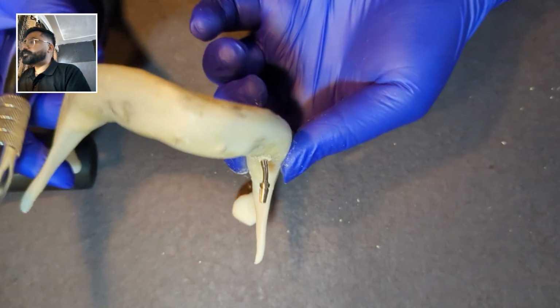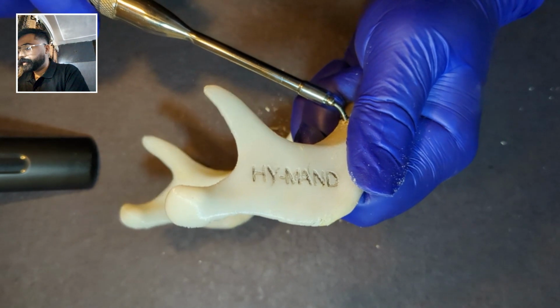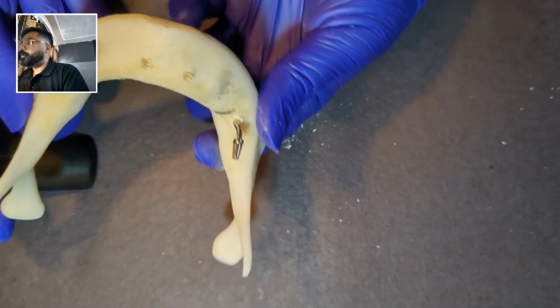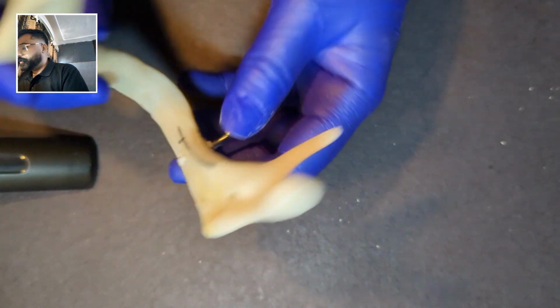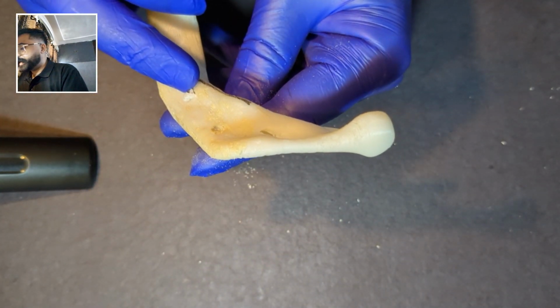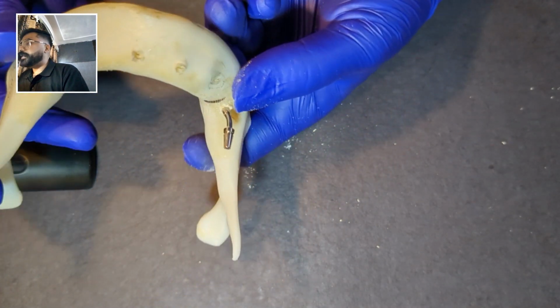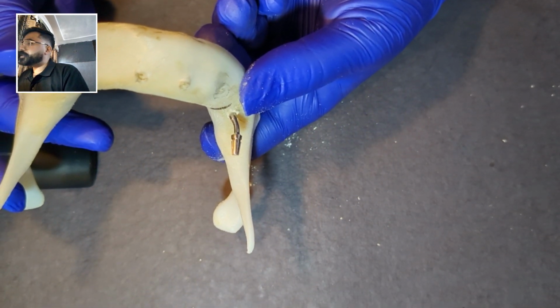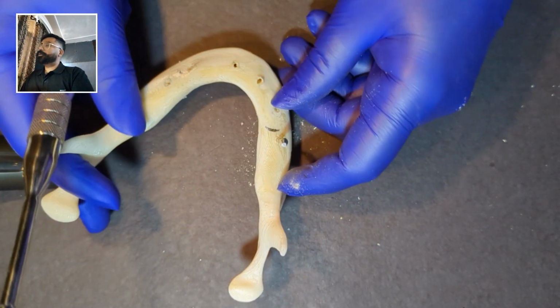Now the implant, as you may see, is in a prosthetically correct position. We may bend it a little further. Now it's properly vertical and properly perpendicular to the ridge. Now we are seeing that I have engaged the lingual cortex and torqued the implant right here and then bent the implant to get it into correct position. So this is how we do lingual cortical engagement in the mandibular molars.